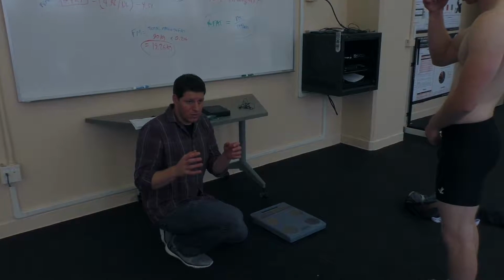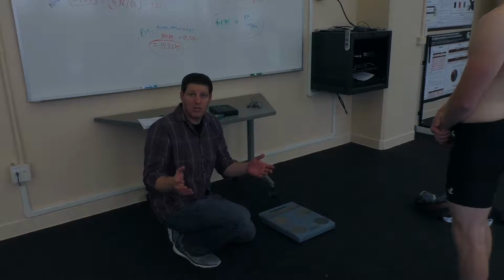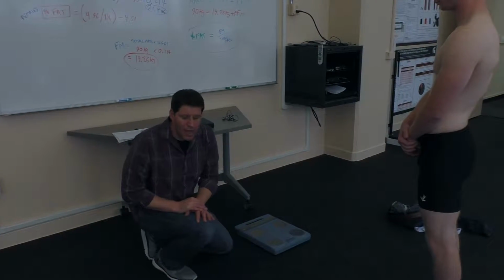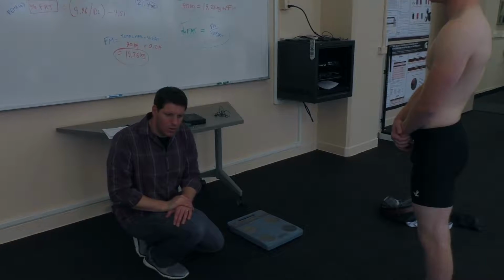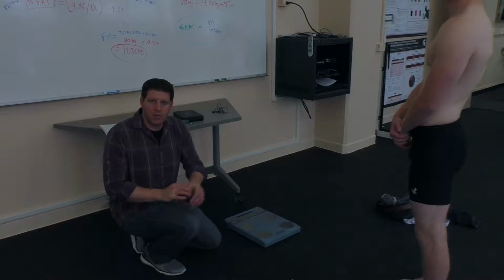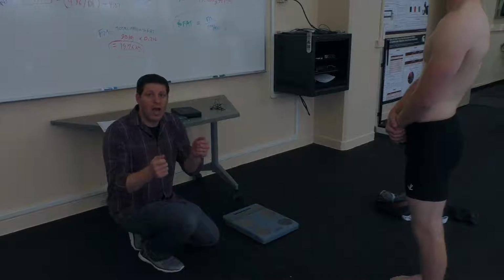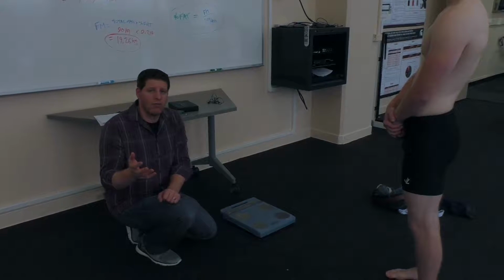Now there are some glaring limitations with that, one of which is hydration status, which we've talked about a little bit already in lecture. As I mentioned, BIA comes in many different forms. If you go to a gym or to a training center, they may have these little handheld ones, and they may even try to convince you that they are highly accurate. As we talked about in lecture, I'd be very careful of that.